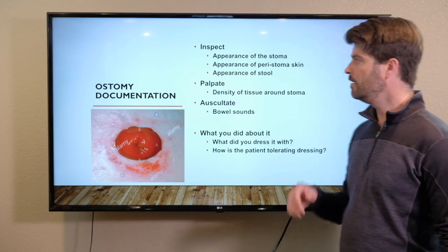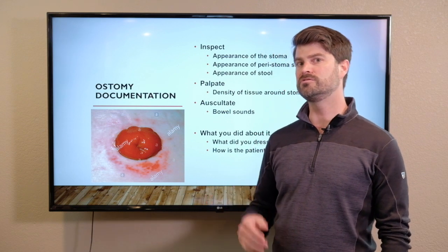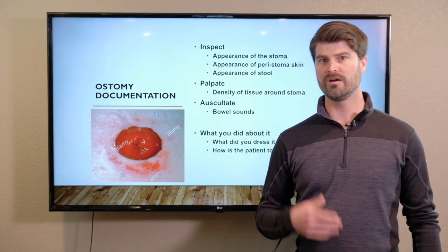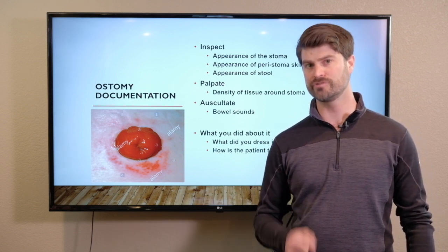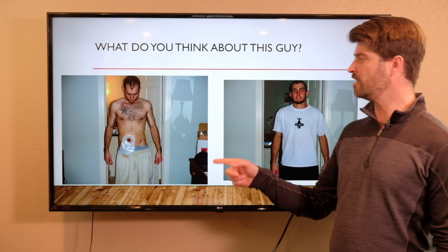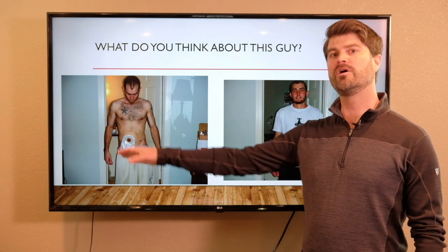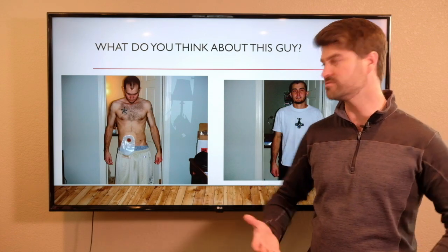2 big things. People are going to be living with these ostomies as an outpatient. So it's super important that as soon as we start taking care of their ostomy, they start getting exposed to how to take care of their ostomy also. So teaching starts immediately after surgery, because this is how people are going to be out there in the world living their normal lives with an ostomy bag. So we need to be able to counsel them about wearing elastic pants so that they can help to keep that ostomy bag secured against their body.